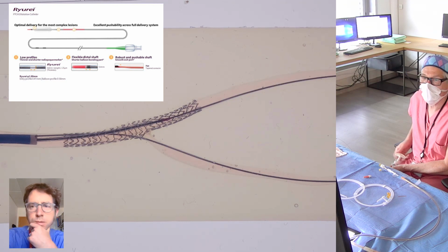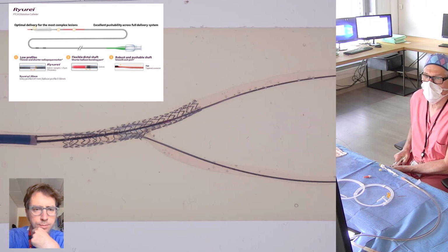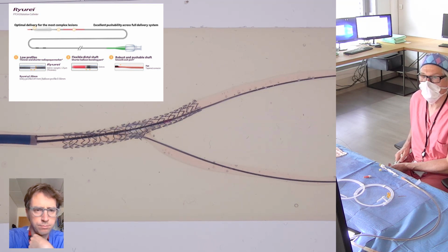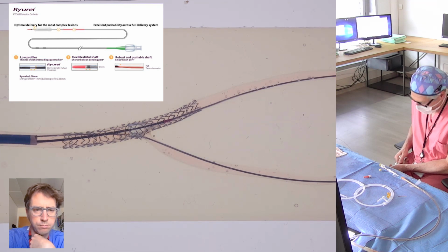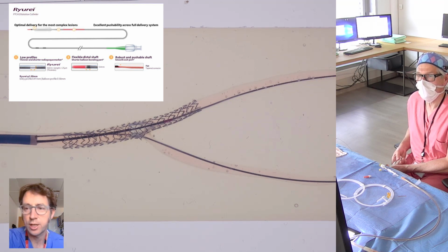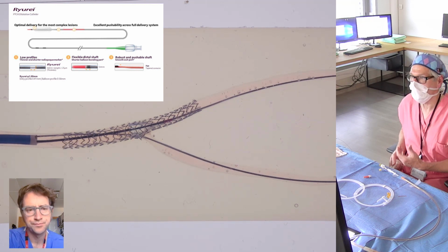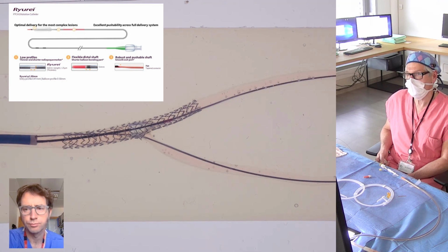There's been a lot of recent commentary about re-POT and being slightly more proximal so as not to disrupt the work that you've achieved with the KISS, isn't there? Yeah, so that's why I'm just proximal to the polygon of confluence. And we can go to, so it's a semi-compliant balloon. Is that just because of the silicone nature of this? Ordinarily you'd use a non-compliant, or you have? It depends. If the vessel is calcified, usually I use non-compliant just to be sure that the stent will be fully open. But in this case, semi-compliant is perfect.